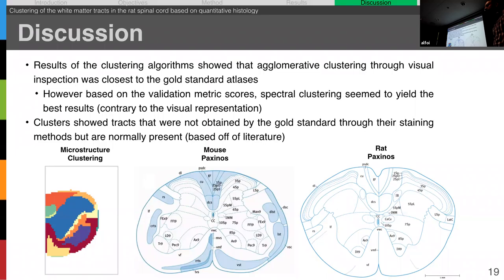Maybe just one last technical point. During the metrics generation, you took the average, for example, of the diameter. Why take the average? How is the distribution? Do you assume a Gaussian distribution, and what would be the alternative? This is for the template generation or for generating the matrix maps, like your 50 micron by 50 micron window. You take the average. Why the average? It's a distribution.